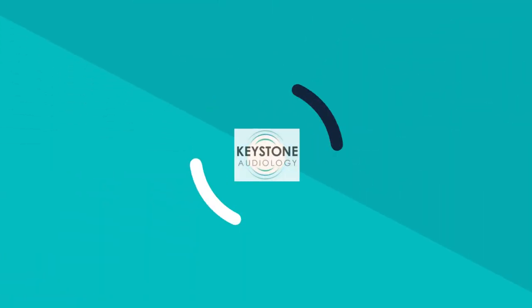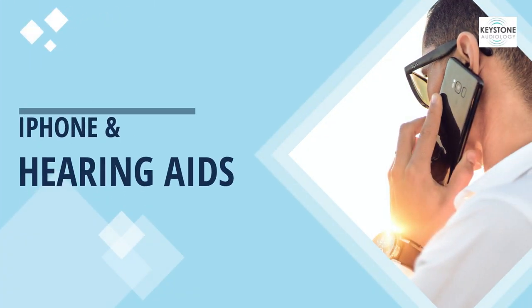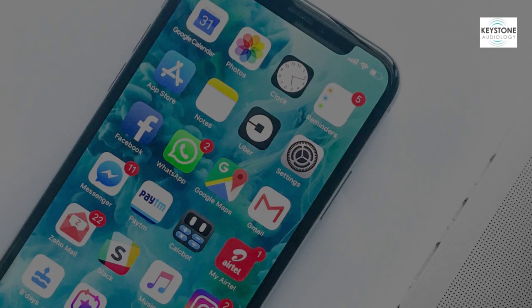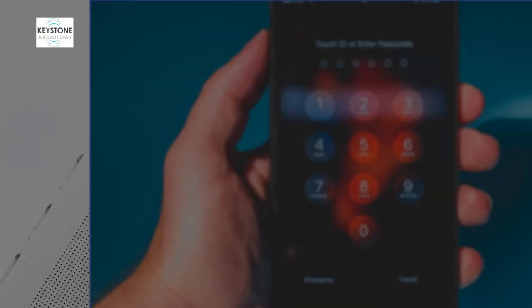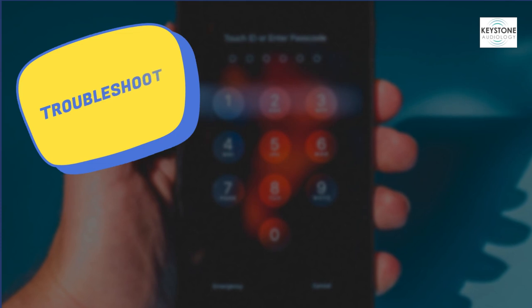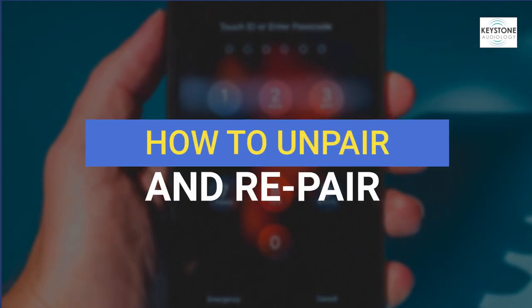Hi everyone, it's Dr. Caldwell from Keystone Audiology, and I am going to talk about iPhone Bluetooth issues today. While features like Bluetooth connectivity can act as important tools of support for our hearing aid users, sometimes the need to troubleshoot pairing issues — such as if your phone stops streaming or the hearing aids aren't connecting to the app — can be really frustrating. This video is going to demonstrate how to troubleshoot these issues through unpairing and repairing your hearing aids to your phone.